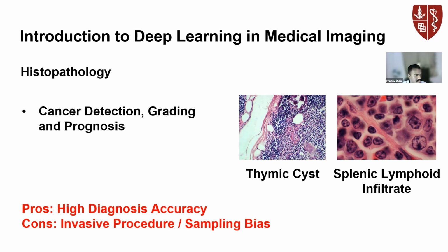Like I spoke about previously, you can do detection, you can also grade them, and you can also try to understand the prognosis of these cells over a period of time. And this is very helpful because histopathology is actually considered the gold standard for diagnosing multiple diseases and specifically cancer, right? So it could help with a lot of problems, right? Specifically for cellular abnormalities, tissue architecture and other microscopic features which are indicative of multiple diseases as well, right?